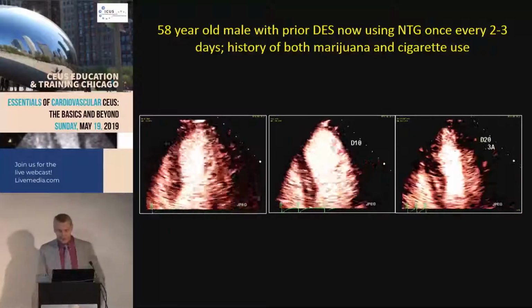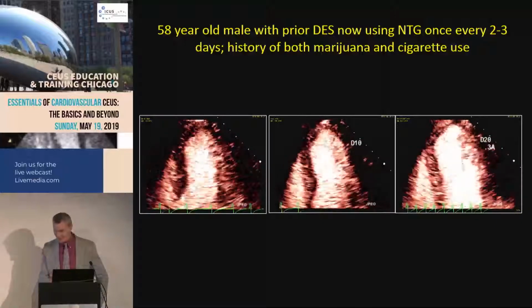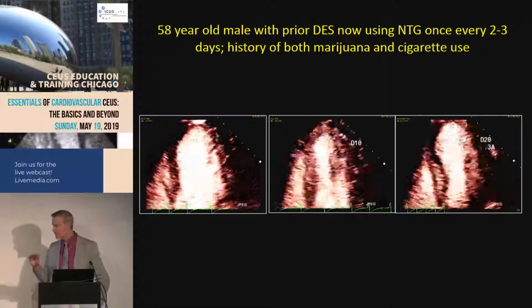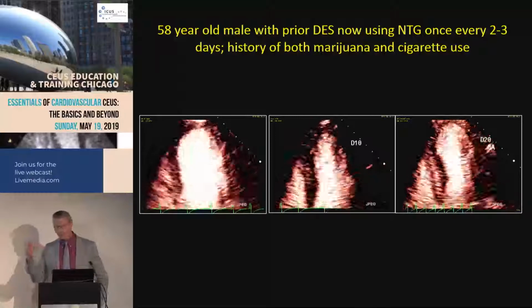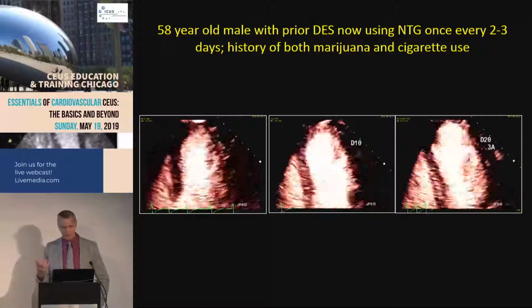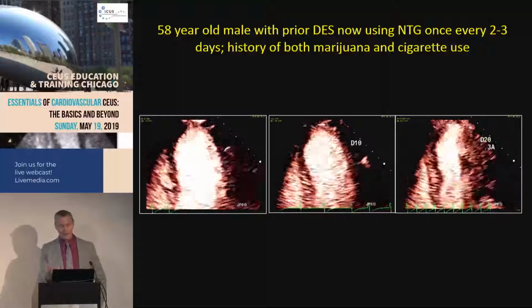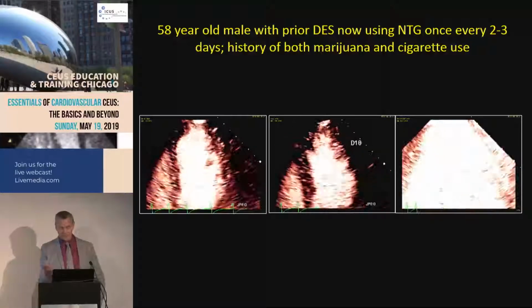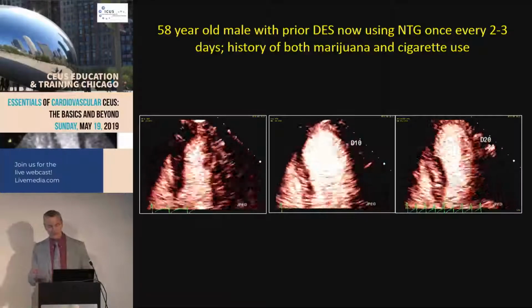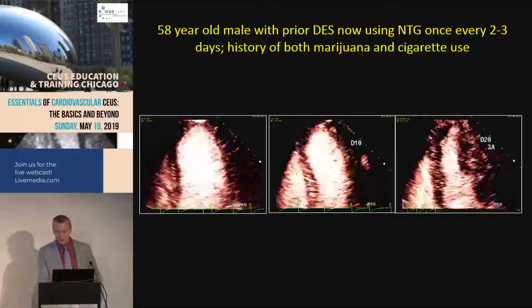But again, this is transmitting. Steve always wants me to talk about this because I want to just remind you, I'm transmitting at 1.8 megahertz, receiving at 1.8 megahertz. So we're looking at fundamental nonlinear response at a 0.18 MI. We never, ever have to go above 0.2 MI for this, no matter how big the patient is. This is the amazing thing about the technique, that we're not transmitting a lot of energy. We're giving a high MI impulse, that's about 1.0 MI, but as you can see, that's that little flash. You see, that's what, five frames, 5 to maybe 10 frames during stress sometimes because of the higher cardiac output. That clears the myocardium, so then we can really see the wall thickening.